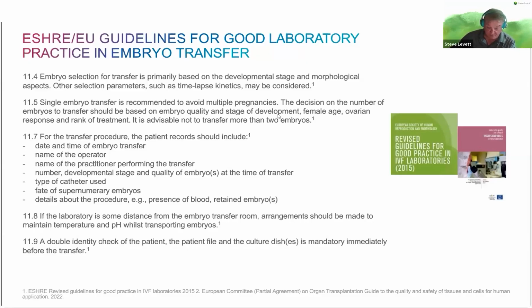Now, this isn't universally applied, but in Europe, it's getting quite strict. And for funding from governments, if you want to have treatment, then you have to abide by these guidelines and you have to have single embryo transfer. Again, we move on a little bit for the transfer procedure.